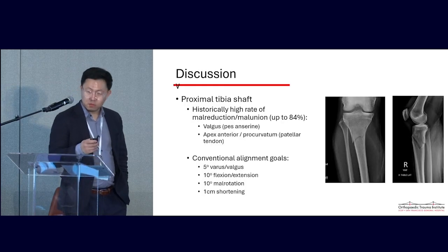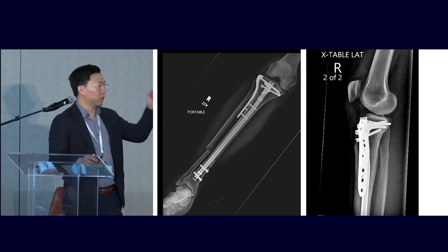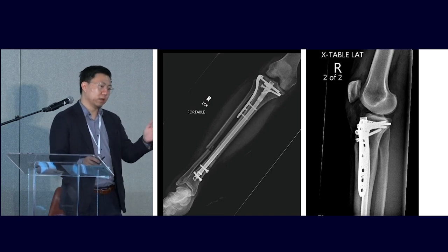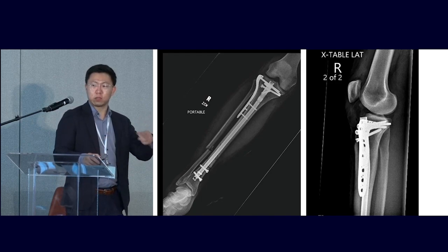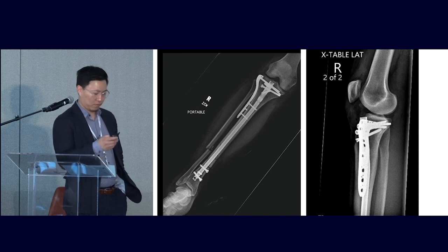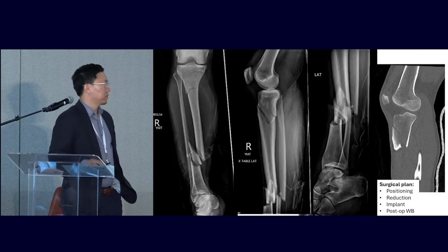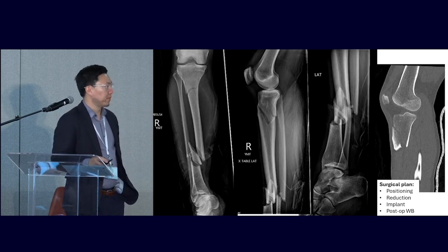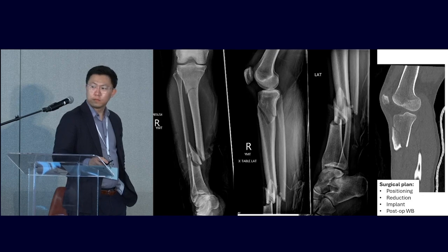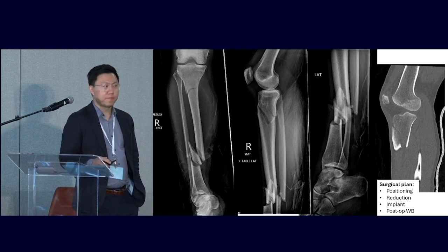Anybody unhappy with that? How much reaming did you do? I still reamed. Yeah, but it was an open fracture at the medial side, so I had to expose the bone and clean everything out. So I had a good read to make sure it doesn't spin. Yeah, if you go back to the injury film, look how small the canal is on the proximal segment. If you didn't ream that a little bit, you're going to have a hard time getting a nail across that fracture site, the distal fracture, without just distracting everything.